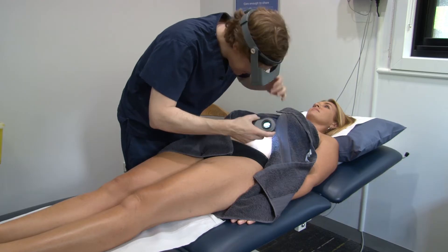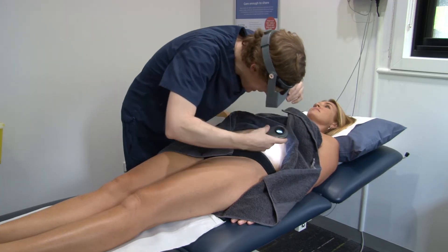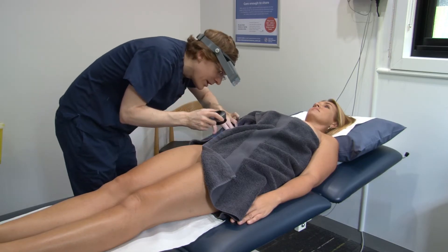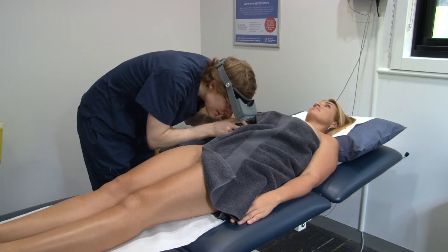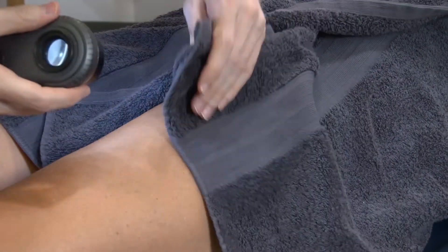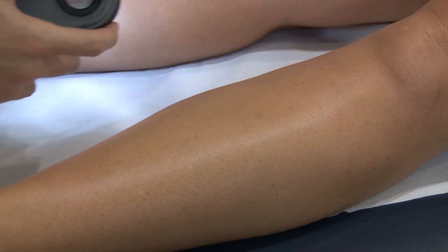Could you please lie on your back. If it's men, you just sort of check the chest, the tummy, move the undies around a bit to make sure I don't miss anything hiding on a hip. You have a little bit of colour in some of your moles — just enough to sort of keep it interesting. I sort of understand why you've had more than one skin check, because some of your moles look a little bit interesting — just a bit of extra colour in them. Then check the thighs while the patient's lying on their back, rock their legs a bit side to side till you get to the ankle on both sides.